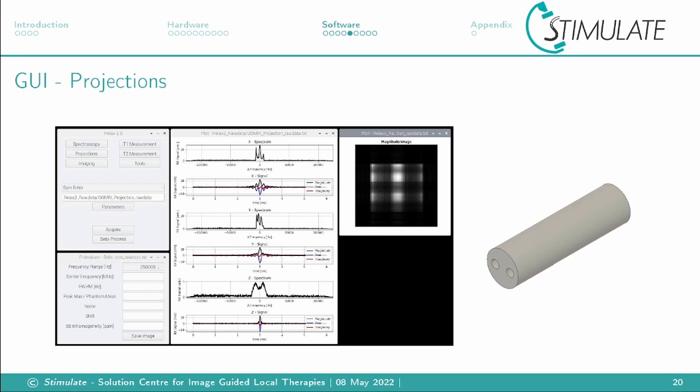When doing projections, a readout gradient along one spatial dimension is applied, like x, y, or z. Here you can see a 3D printed sample with two small holes, where the water is in and where we get the signal out. When the gradient is applied orthogonal to the holes, just one peak appears. This you can see in the X spectrum. When the plane is along the holes, two peaks will appear. This is what you see in the Y spectrum. And when combining X and Y spectrum by just multiplying them, you get a simple reconstruction which you can see in the image.